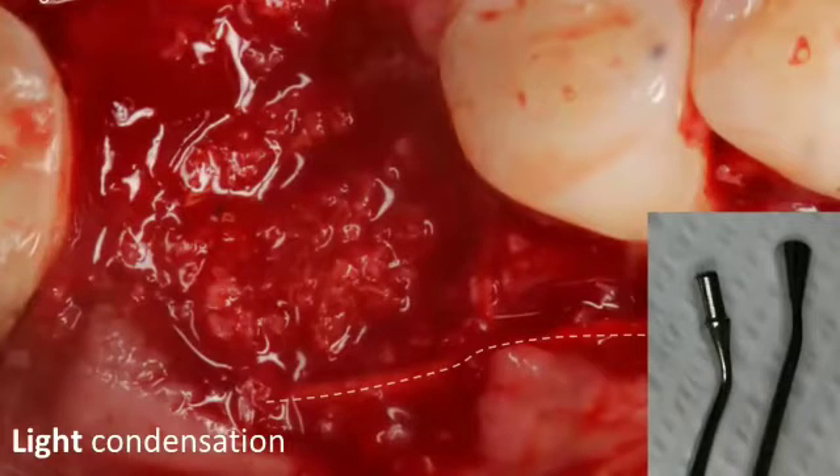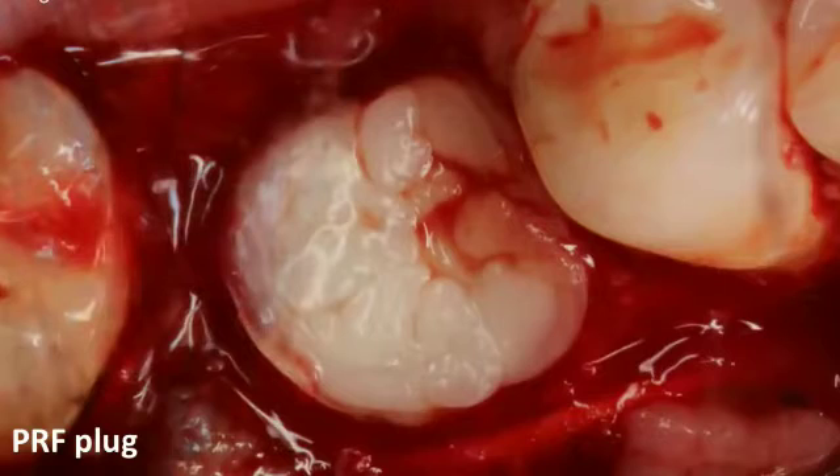Use light condensation when you're missing the buccal plate, because applying too much force may push bone graft through the defect and push the membrane out — forces need to be light to moderate. Using the compartment technique, once you've completed the buccal wall, you need to place something on top to seal the socket. You can use a collagen plug cut into a disc, or in this case I'm using a PRF plug. The PRF has a biologic advantage of inducing better and faster healing, as far as I can tell.